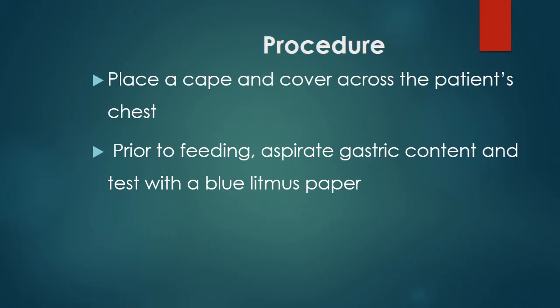So aspirating would let us also know that yes, absorption has taken place, or the food that was earlier given is still inside, and for that matter, there may be the need for us to delay or withhold the feeding. So we aspirate purposely to confirm correct placement and then also to determine whether there was malabsorption.